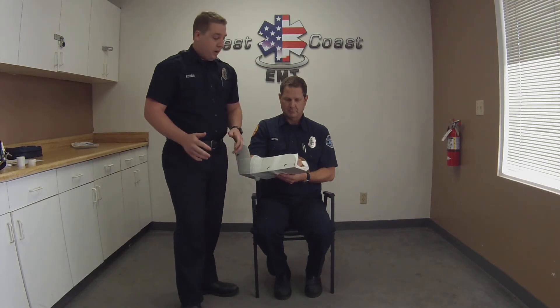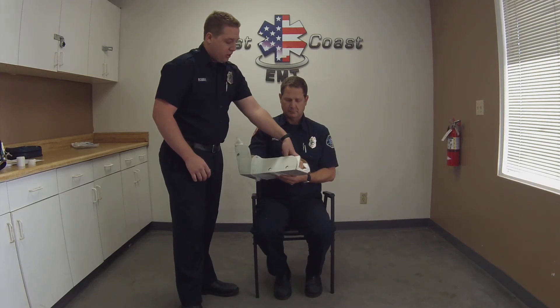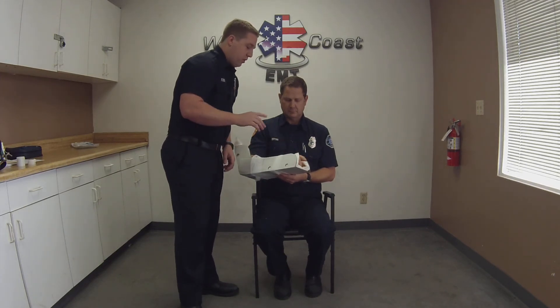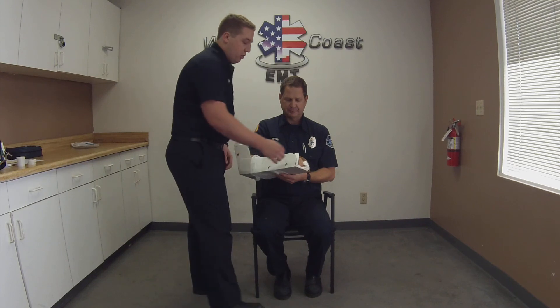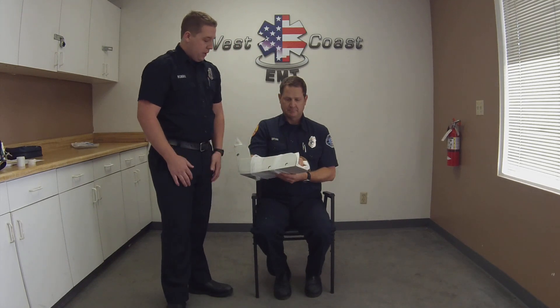Before I'm done, since I mobilized something, I want to recheck his PMSCs. I'm going to recheck his pulse, recheck his motor by having him wiggle his fingers, recheck his sensory by asking which finger I'm grabbing, and check his cap refill one more time to make sure those are all adequate. And that's long bone mobilization.